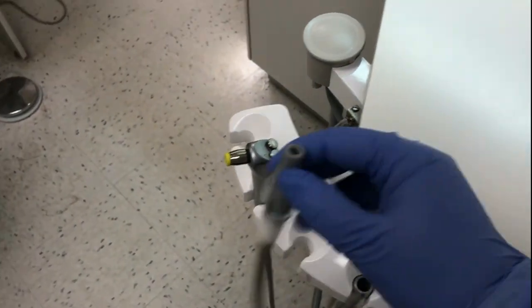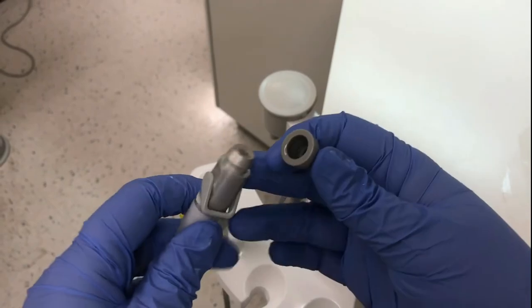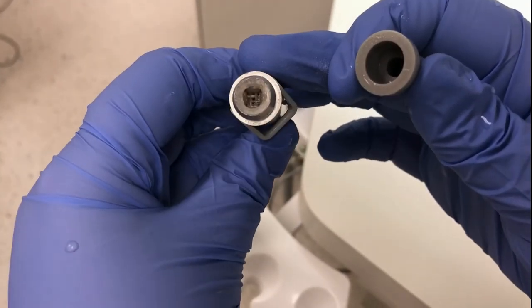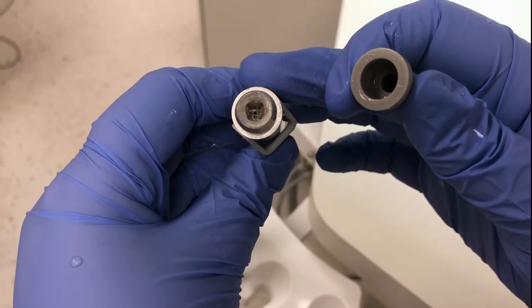Pull off the gray silicone cap to check the saliva ejector trap. If the holes are still visible, you don't need to change the trap.